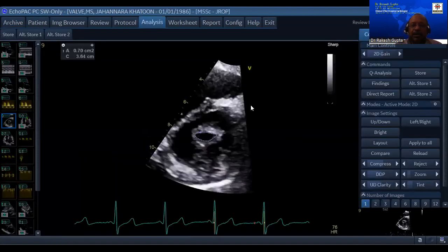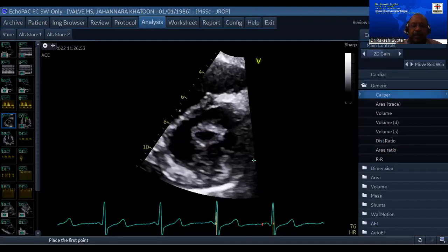All right. Now you got it very clearly. Okay, sir. Now this is thickening. I showed you one which was not thickened. Now this is classically thickening, on both the sides. And this has got a calcium on top of it. Okay. Sir, will there not be any gap between these two?